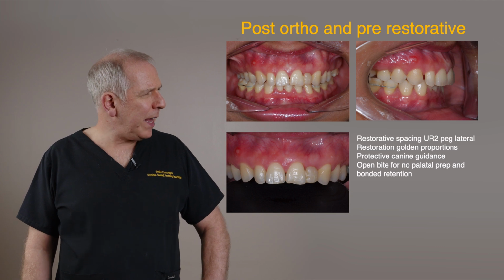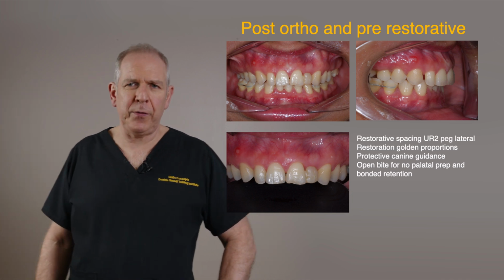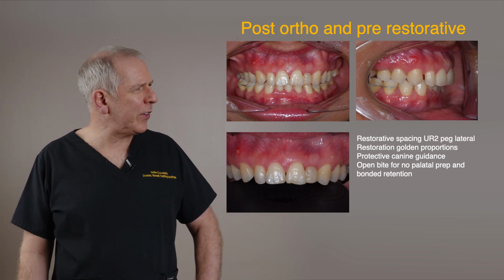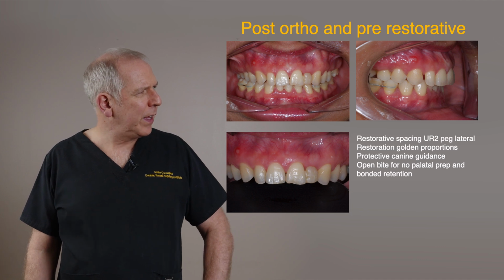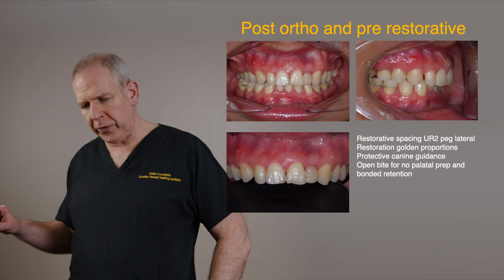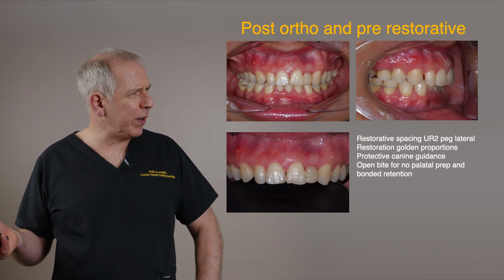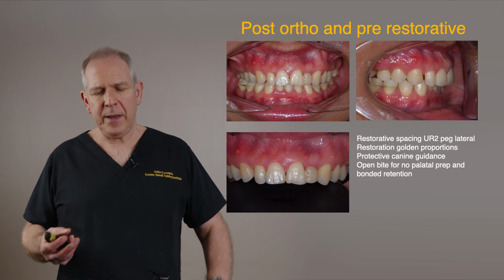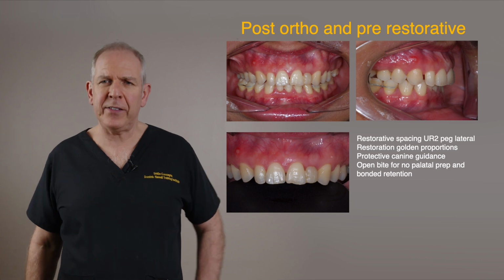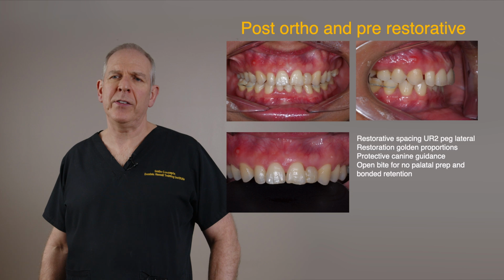But here's post-ortho. And this wasn't 6 months of ortho. This is a more substantial ortho. But look what the orthodontics has done for us. In the lower arch, it's got rid of all the spacing. So really restoratively, a bit of reshaping of those lowers will be done. It's decompensated that deep traumatic overbite. And look, it's lined up the canines nicely.